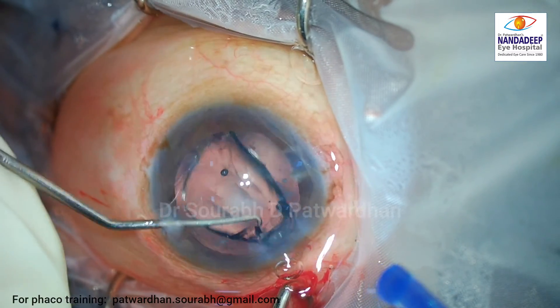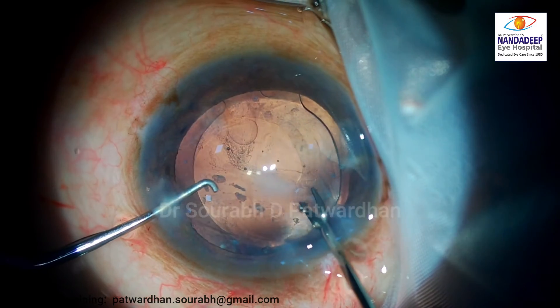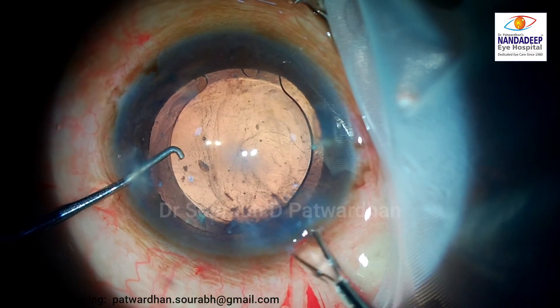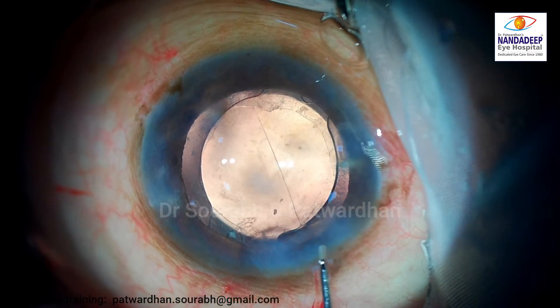That area of fibrosis you can leave as it is, but here I decided to go ahead and just remove that part as well, including it as part of the rhexis. And that is the end of the surgery.